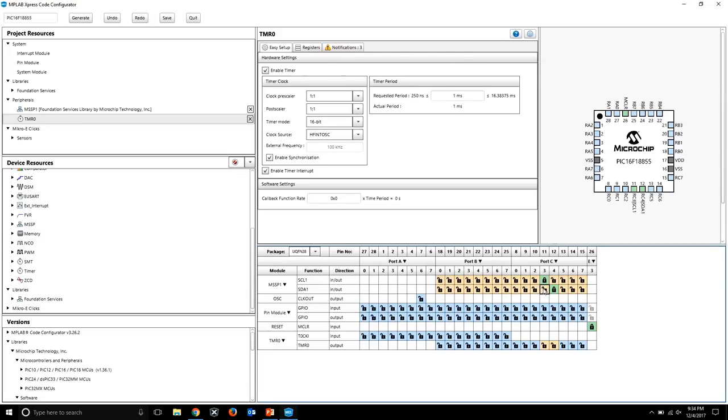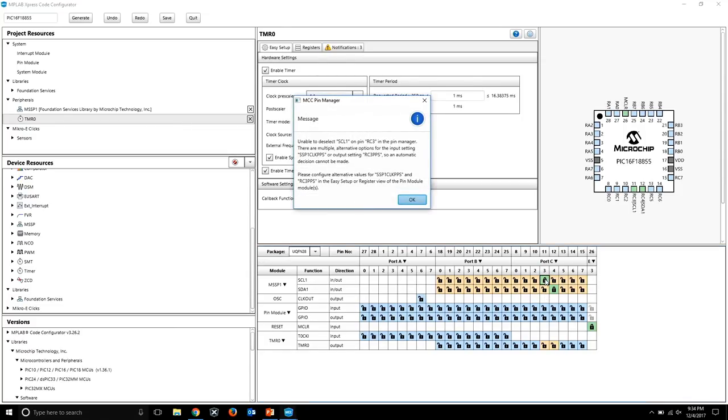Now the problem is once it wants to move from RC4 to RC3, RC3 is already selected for the clock line. So MCC is telling you that if you use RC3 as a clock, I2C does not work on the same wire, so you have to select something else. Okay. Now at this point, you think, how about I just deselect this? You try that, but it doesn't let you do it either. So you have to do the other one first?